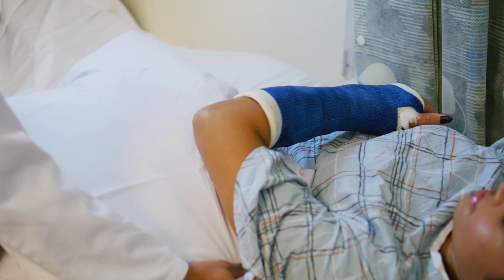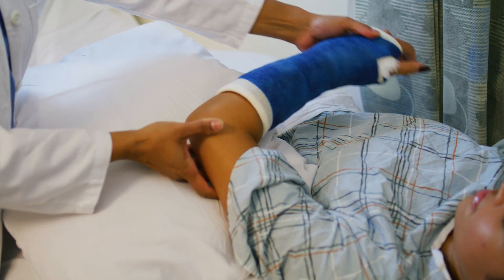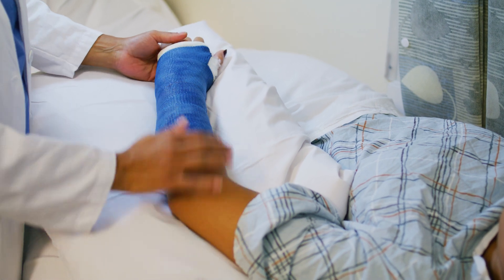Sleeping with a cast can be challenging. Place pillows underneath your cast to reduce swelling and increase circulation.